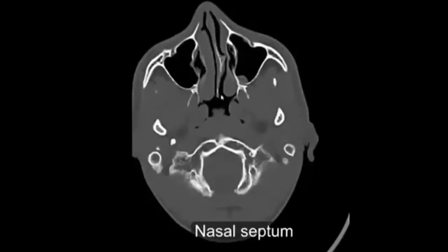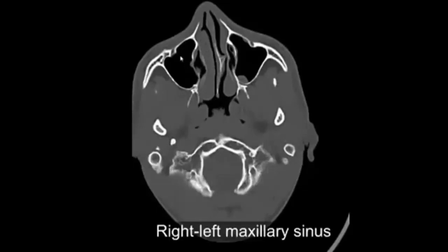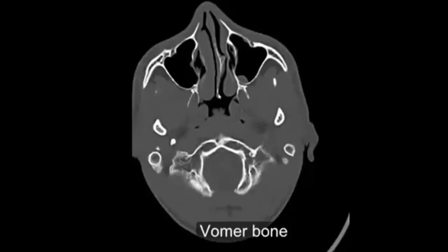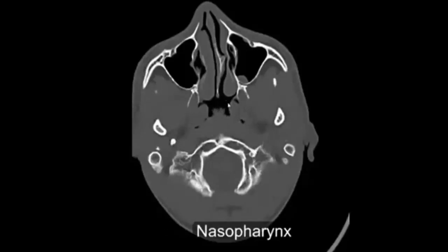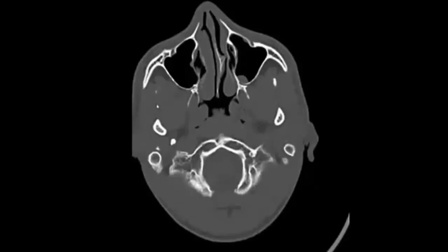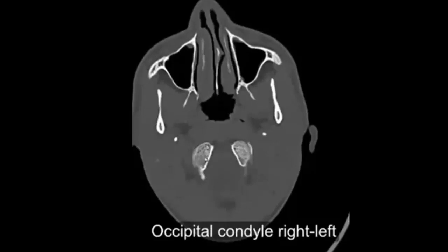Nasal septum. Inferior turbinate, right and left. Maxillary sinus. Infraorbital foramen, right and left. Vomer bone. Nasopharynx. Pterygoid plate. Palatine bone. Mandible. Styloid process. Occipital condyle, right and left.